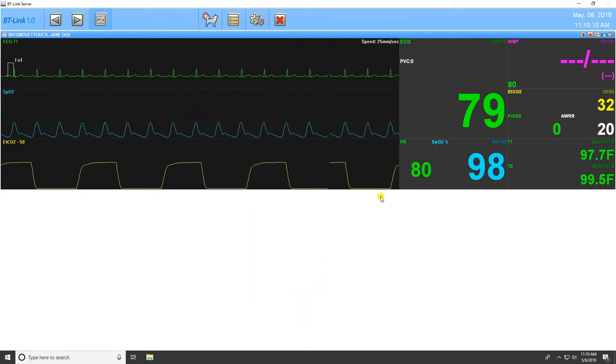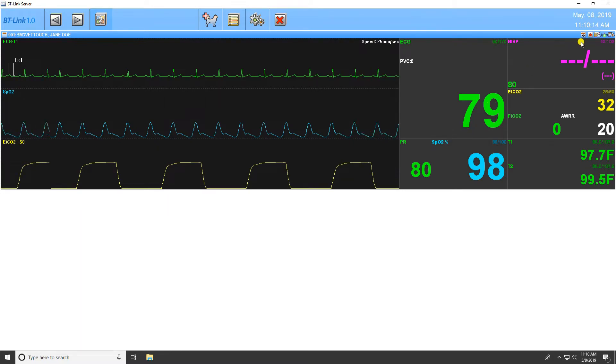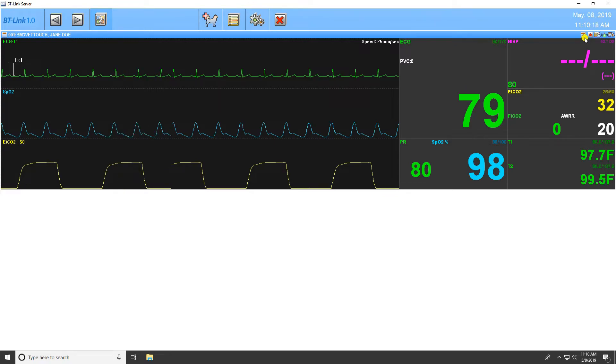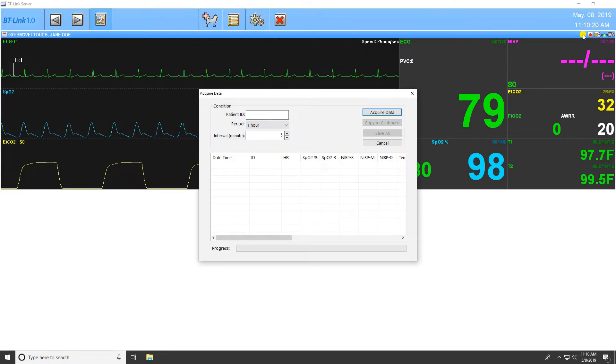The last functions we will demonstrate in this video are the buttons in the right corner above the client window and underneath the time and date. The first icon on the left is the Acquire Data function, or Batch mode.